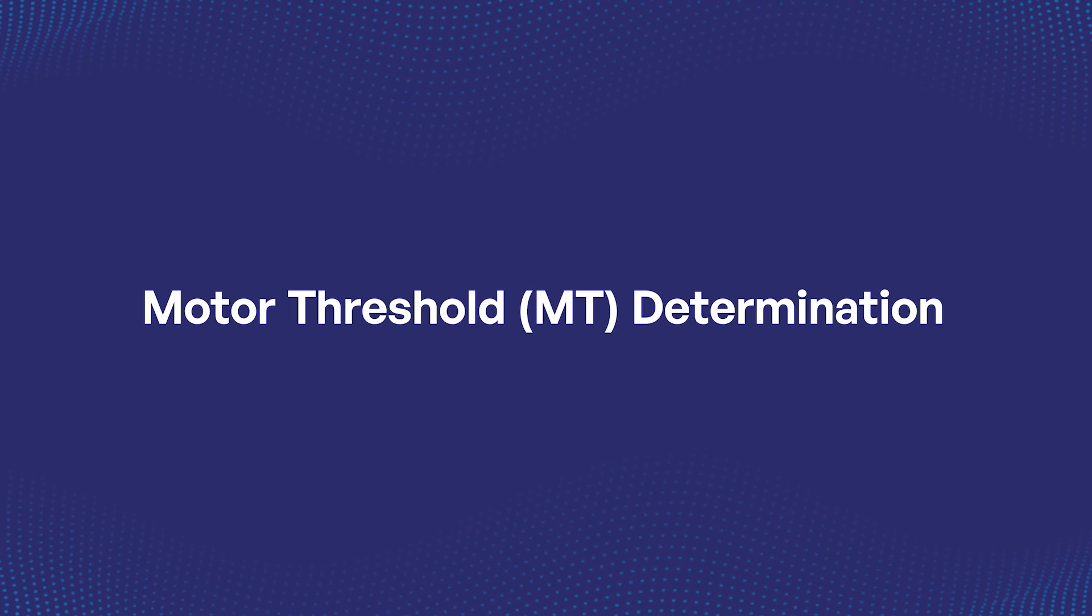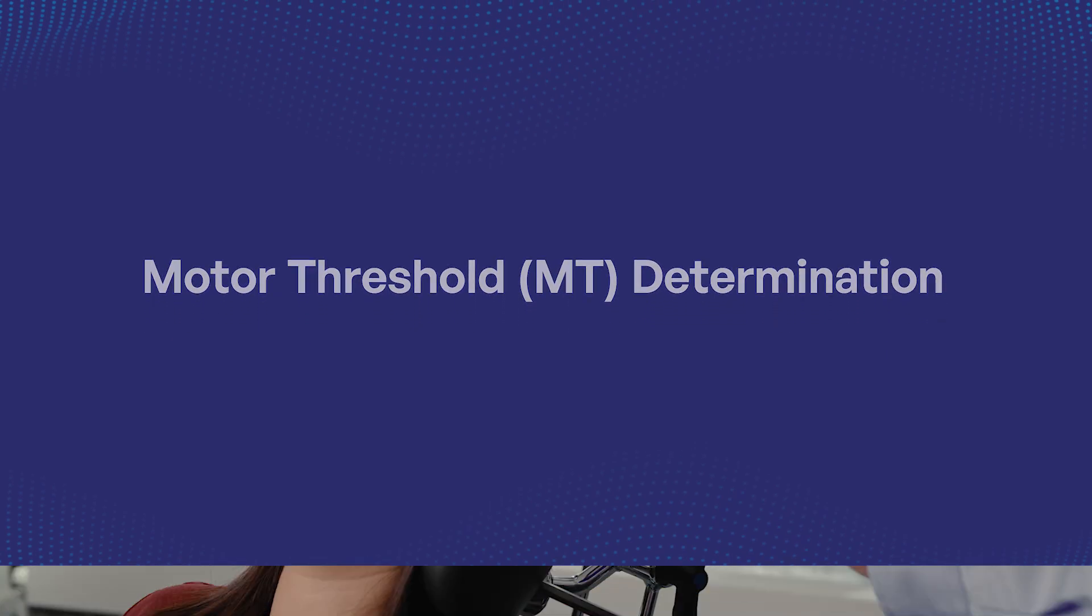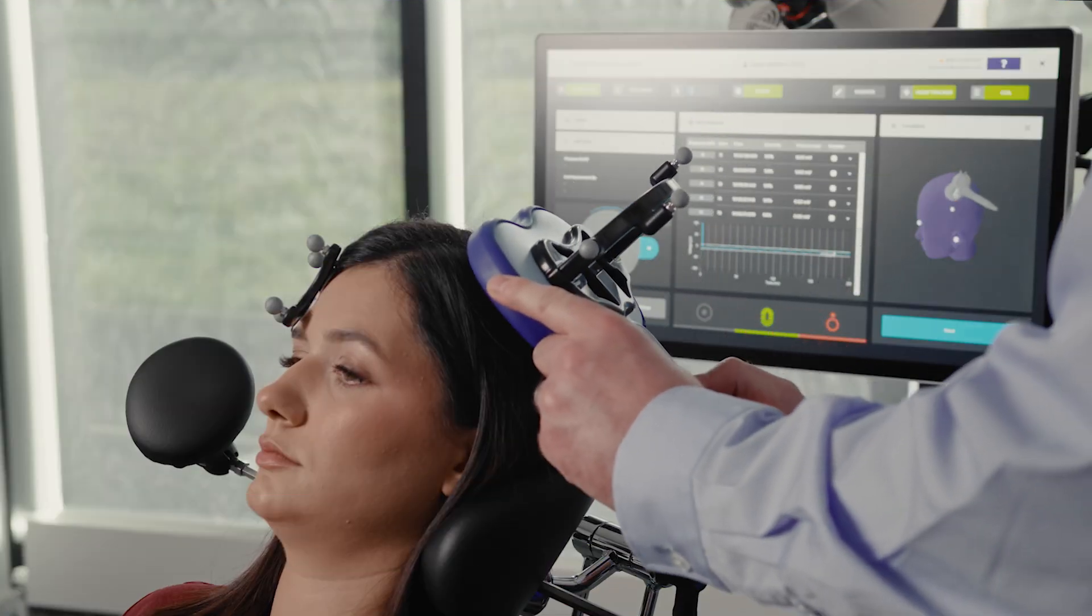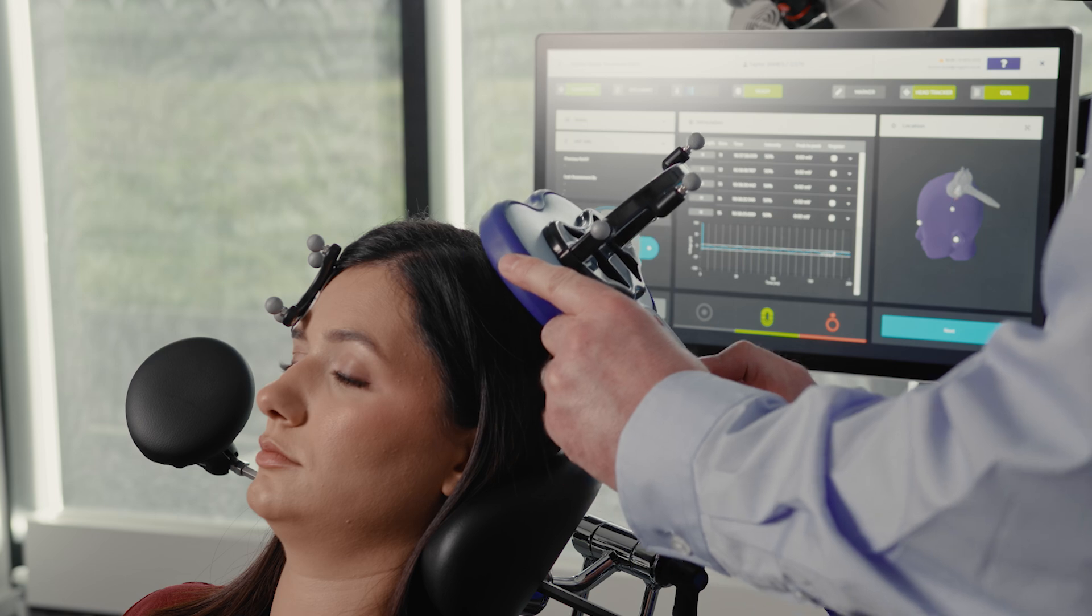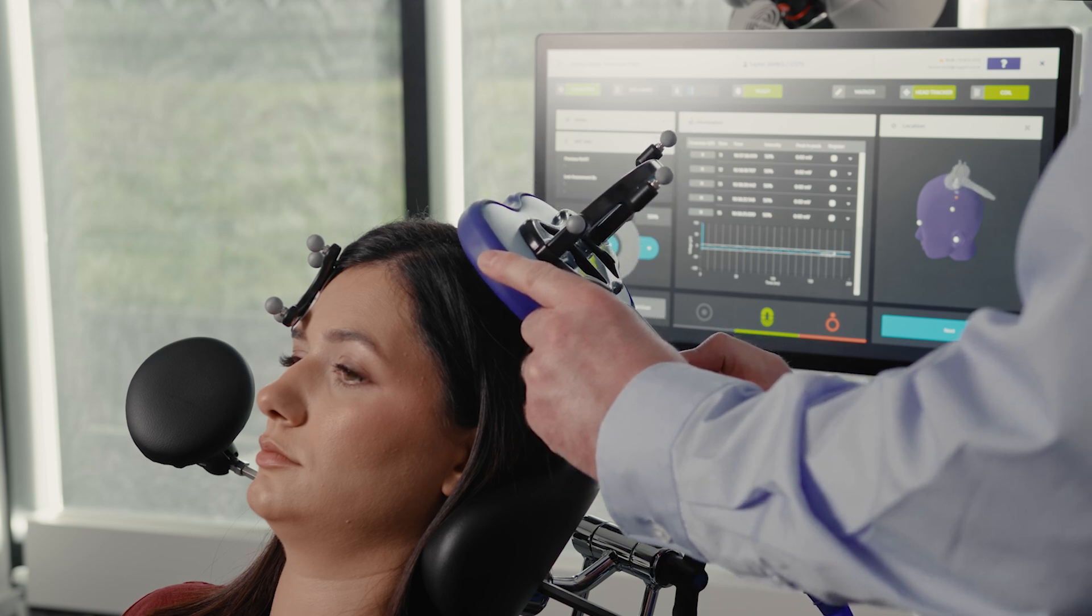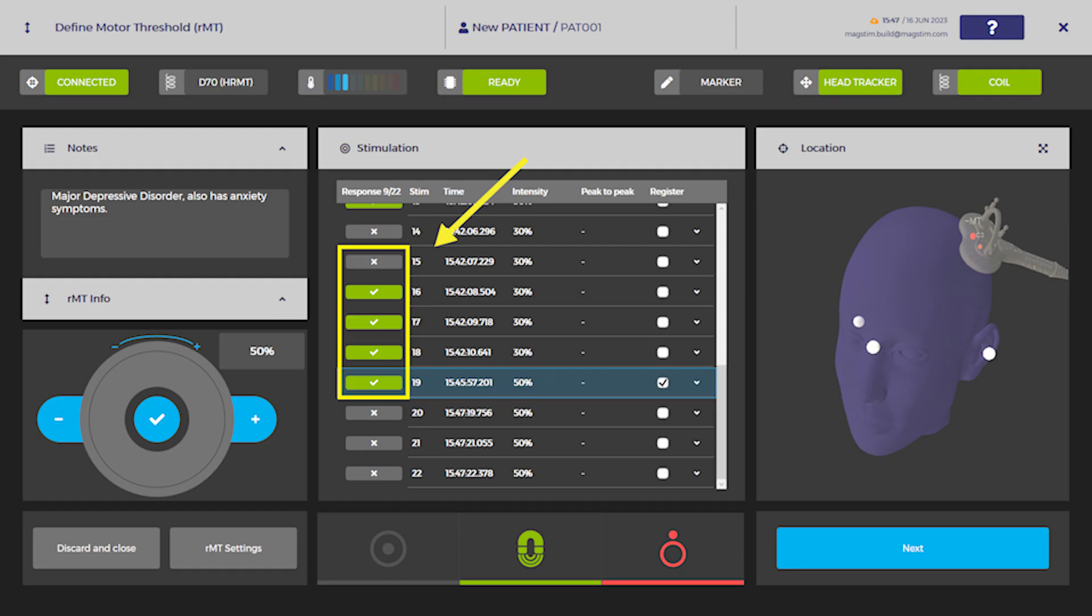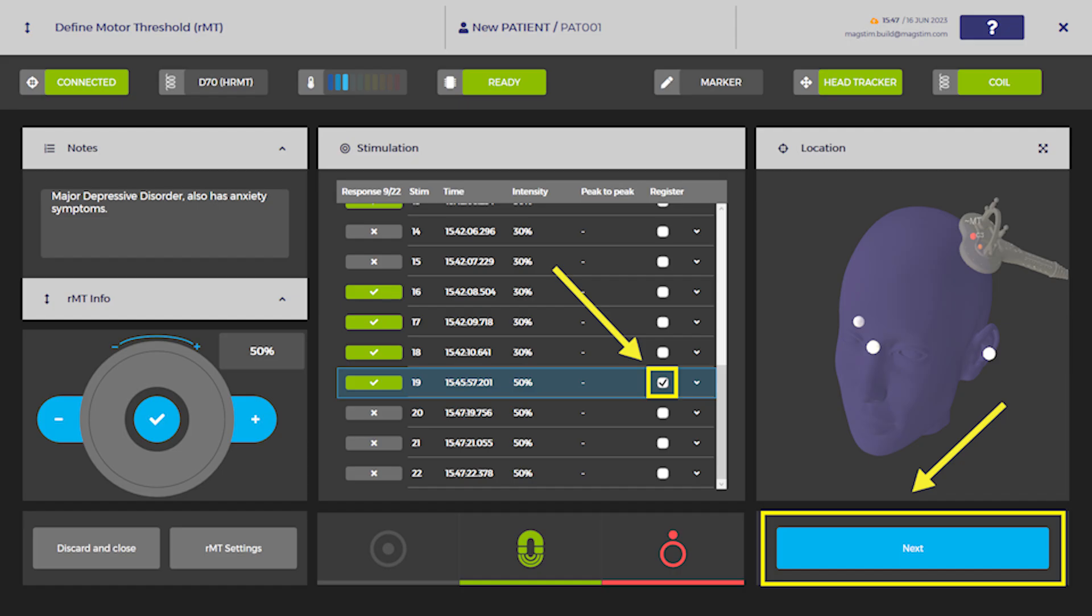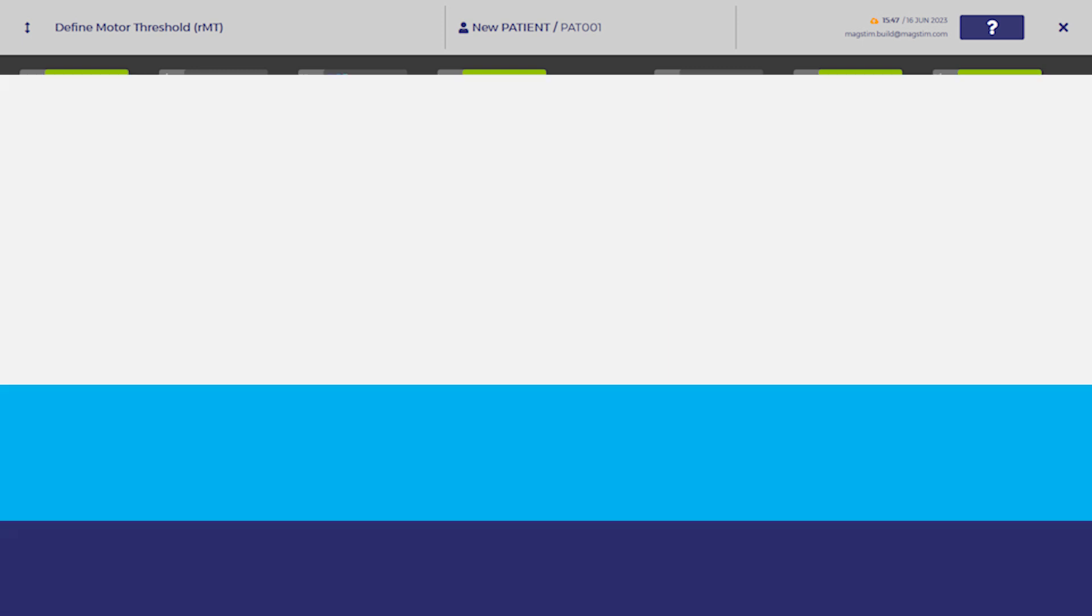Motor Threshold Determination: Place the coil over the Hotspot target. Using the previously defined stimulator output, deliver 10 pulses at least 2 seconds apart. If a positive twitch is observed, this can be recorded by pressing the check icon in the response column within the stimulation panel. Use the response flowchart to adjust the power level based on the observed responses. The resulting stimulator output is the patient's motor threshold. On the Horizon UI, register the desired response and press the blue check icon.